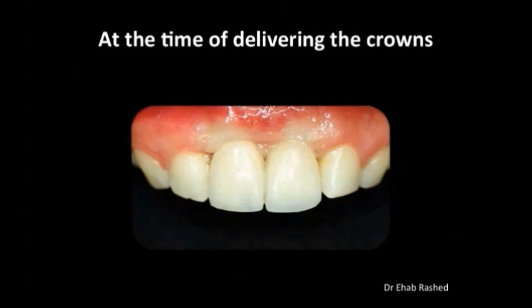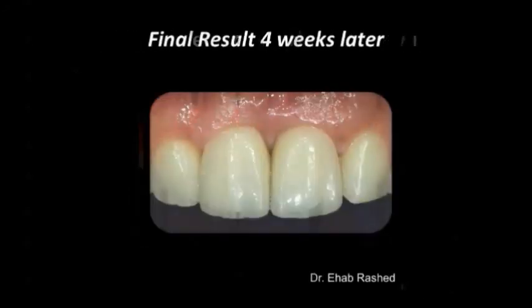And this is the day of the insertion, and this is 4 weeks later. As you can see, a final good result 4 weeks later. The gum has healed. The emergent profile of the crown looks very well. The soft tissue all around the papilla looks healthy. It healed nicely, and the buccal bone is still there. And you can see also the stippling of the gum and the nice emerging profile of the crown.